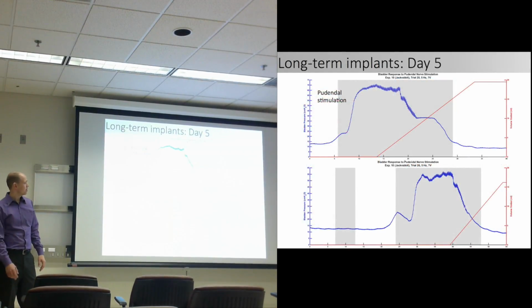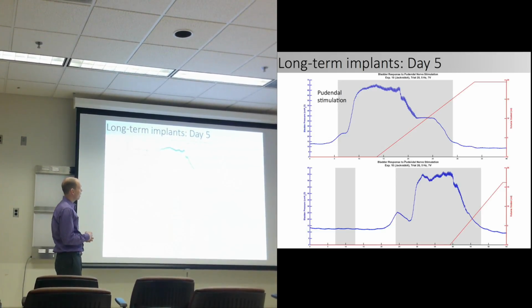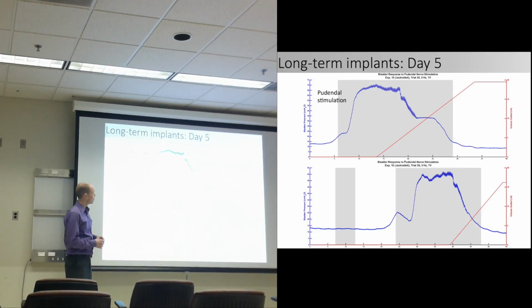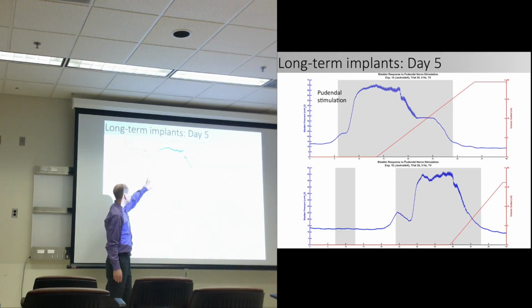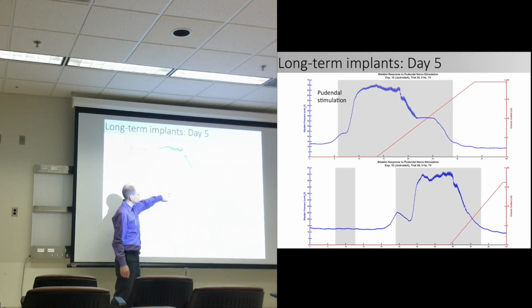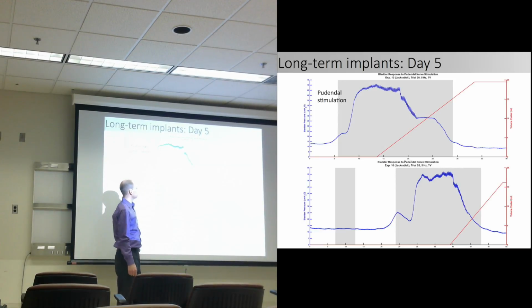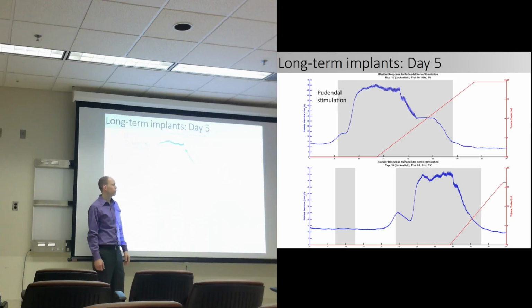The other thing we did in our one trial so far this week, which is 5 days after the implant, was look at stimulating nerves to restore driving bladder responses. I did place some nerve electrodes, which were able to drive large bladder contractions. There was a bladder pressure, we turned the stimulation on, and it led to a very large bladder contraction. And then you also have bladder voiding. So this red line here shows that you got about 20 mLs coming out in about 10 to 12 seconds in this trial, which is much shorter than the under anesthesia results that I got from before.